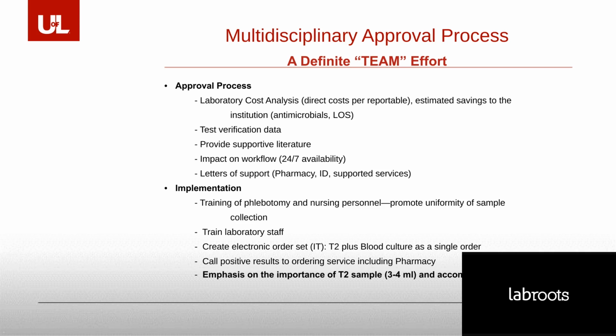Once again, it's been a learning environment, to say the least, but we are seeing more and more of our medical staff becoming comfortable with how to order it and what is needed. We call positive results immediately to the ordering service, including the pharmacy. And once again, we place great emphasis on the importance of that T2 sample being accompanied by a blood culture.